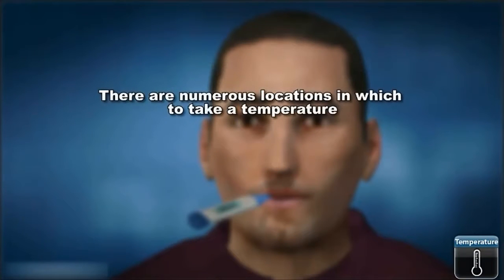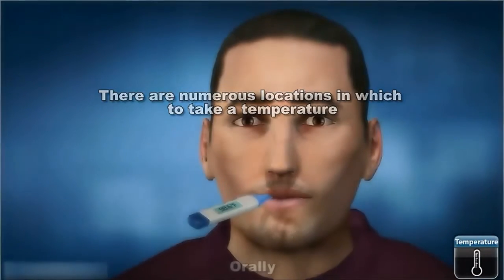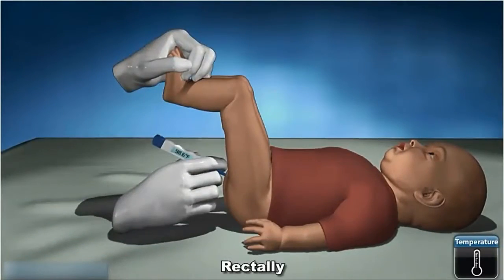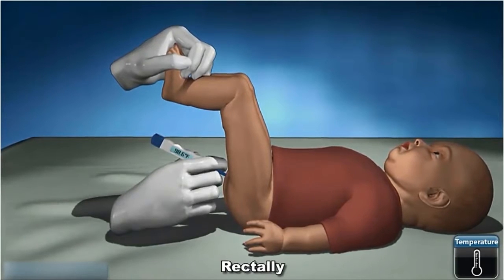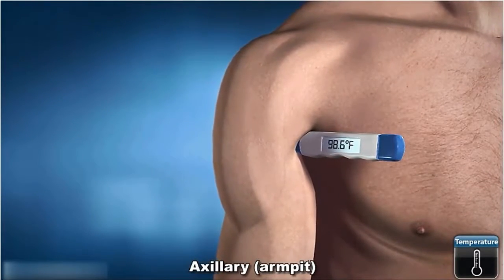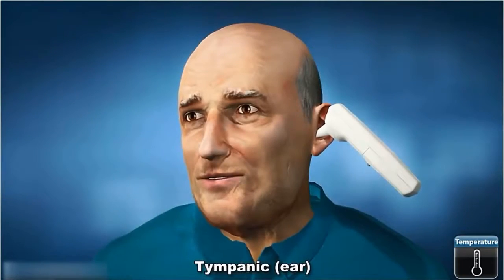There are numerous locations in which to take a temperature: orally, rectally, axillary or armpit, or tympanic ear.